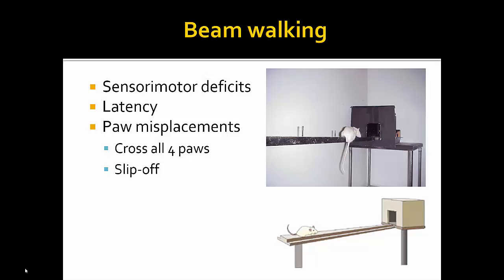There's a pre-training day, and then you do your injury, and then depending on how many days out you want to do the study. In the other kind, you want to look at paw placements when they have these pegs sticking out. You want to see their coordination. How easily are they able to go around these pegs or over the pegs and stay on the beam? It'll be the same thing: a really bright light and a loud noise, and they have to run away from it.